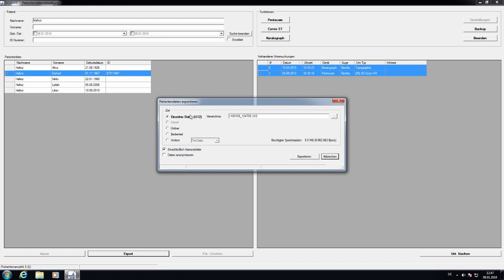And as you can see here, this software is in German, but in English it would say Single File U12. And then it will give you the path and the name.